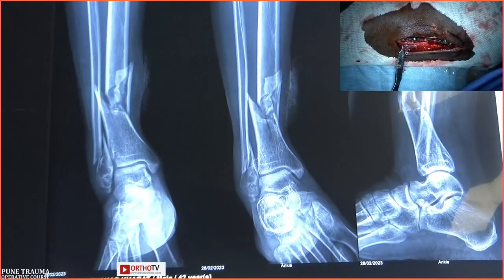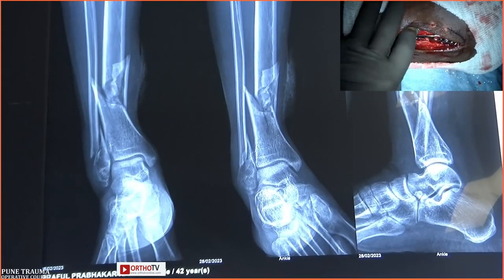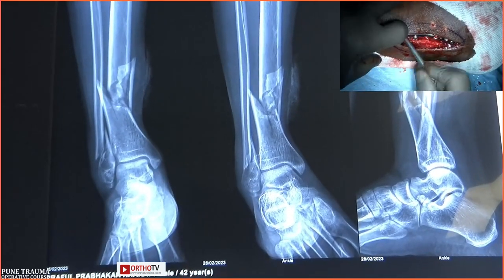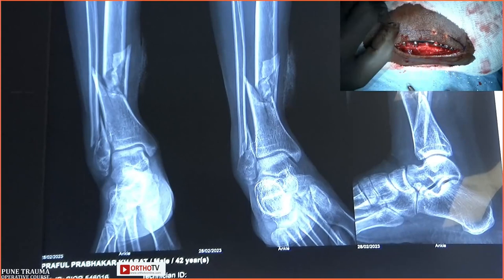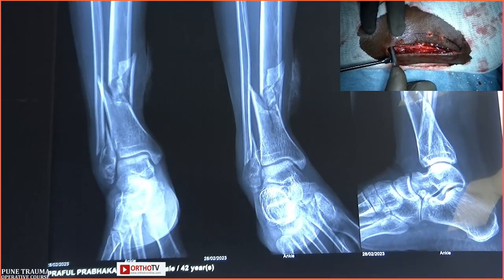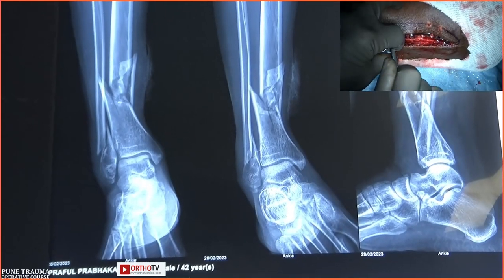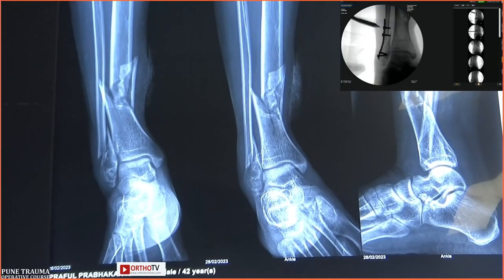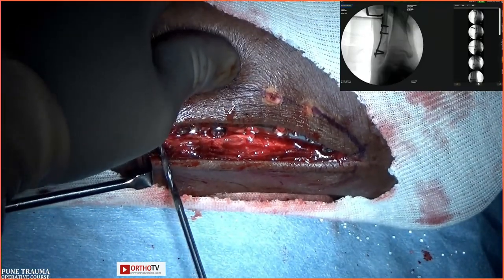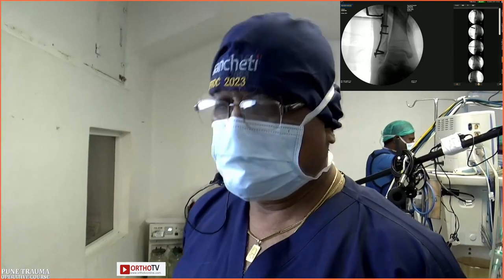In these situations where I have a comminution of the tibia, I would like to temporarily stabilize the fibula first, just to get length, rotation and alignment, which is important to help reduction of the tibia, rather than having a definitive fixation of the fibula. Because with the amount of comminution of the tibia, if I fixed a relatively uncomminuted fibula first, I stand to leave gaps at the tibia, which will probably be a day one failure. So I want to stabilize the fibula, not do a definitive fixation, then do the tibial fixation, and come back to the fibula and finish its fixation. So those are my two pennies worth of thought.